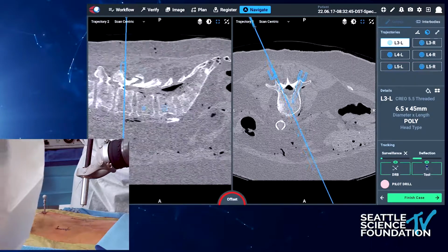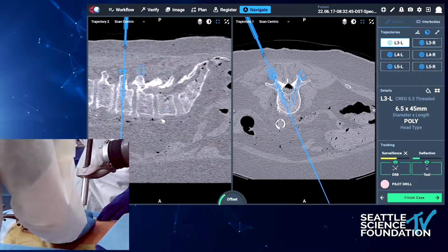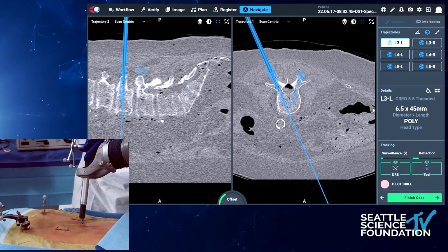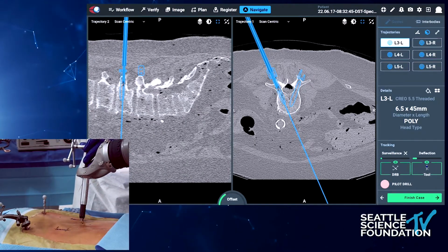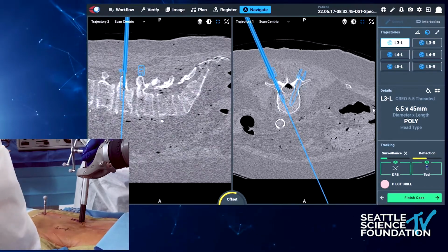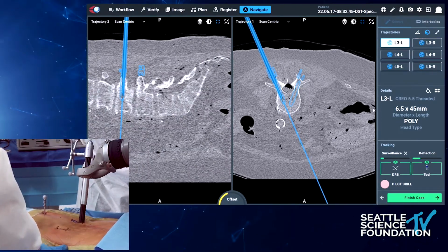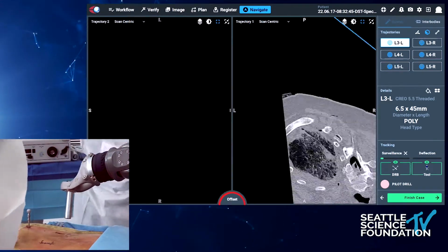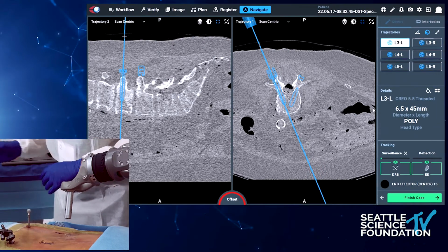Part of the reason why is, if you let go now, it should be more accurate. There it is. Again, that shift that I was talking about is an issue. So if you see, that's the maxed out length of where the drill will take me. And the next step for me is literally the screw.